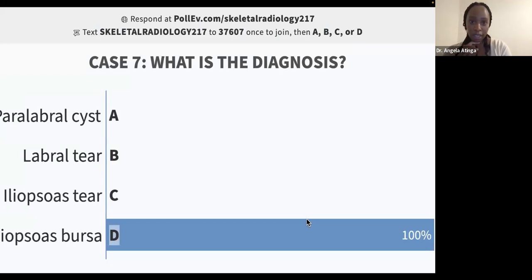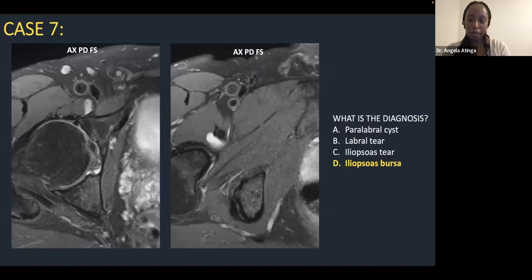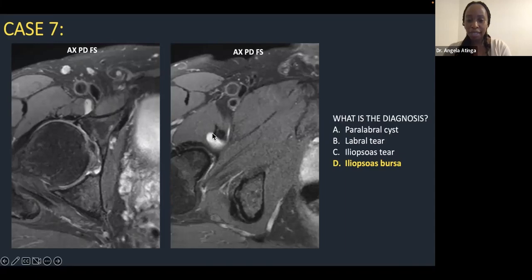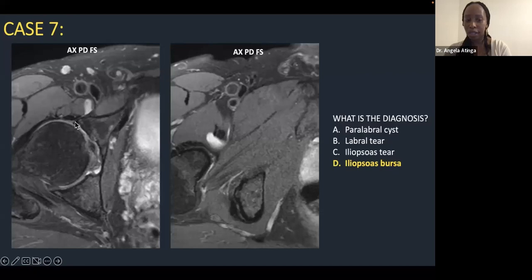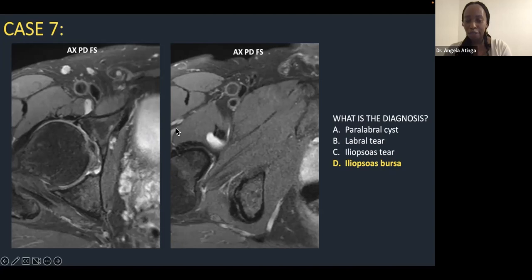Case 6: iliopsoas bursa. You can see fluid at the anterior aspect of the hip surrounding the iliopsoas tendon on the inferior slice. This is a common point of confusion with a paralabral cyst, especially if you don't have fluid tracking inferiorly — the bursa sits very close to the labrum. You've got to look carefully and determine whether the fluid is surrounding the iliopsoas tendon or actually in relation to the labrum, using all planes of imaging to make that distinction.